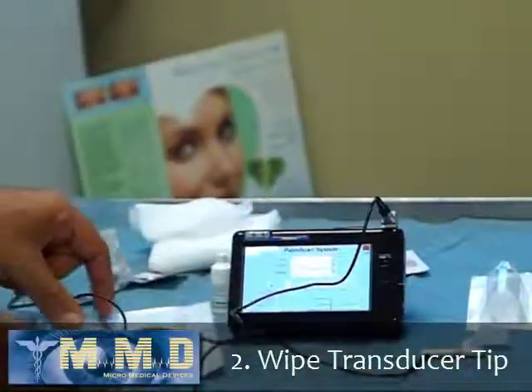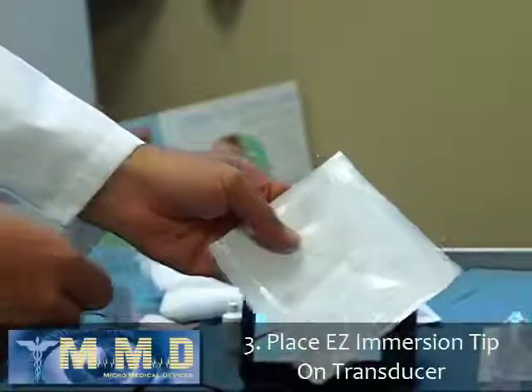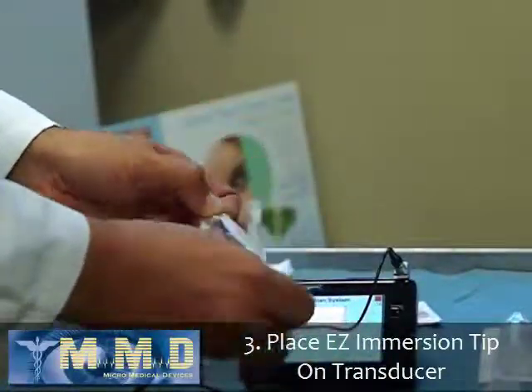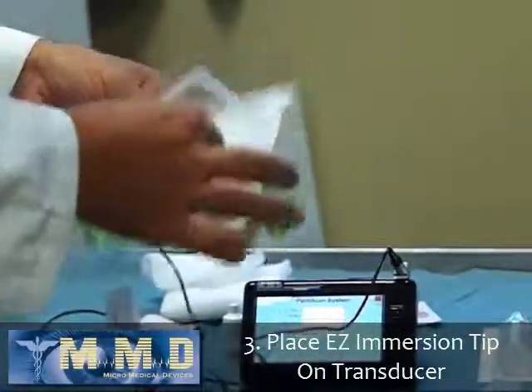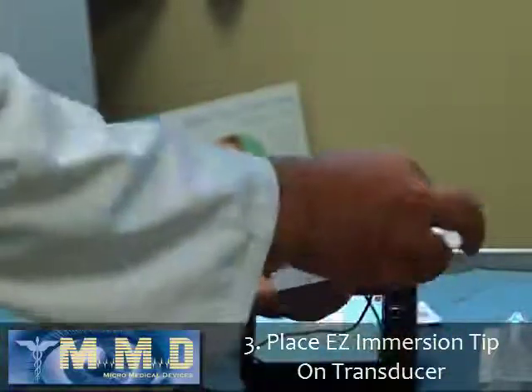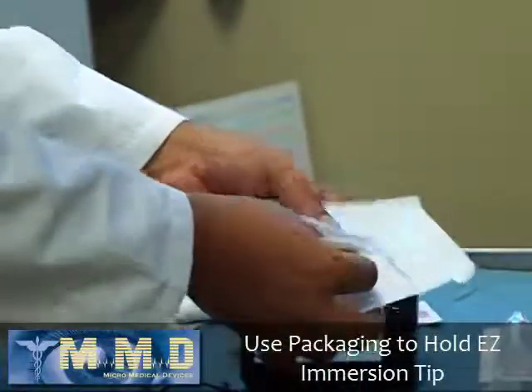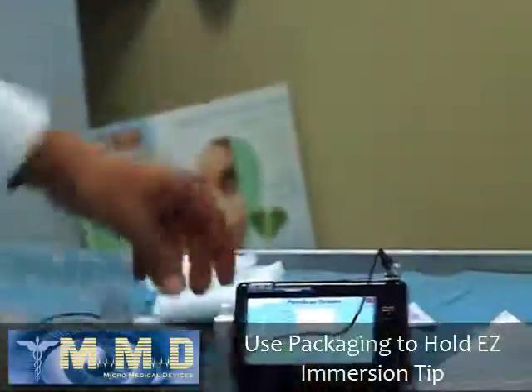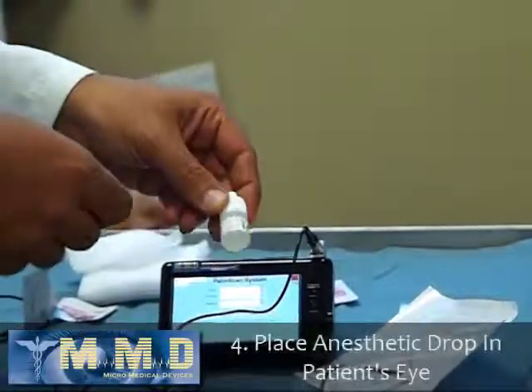And now I'm ready to place the EZ Immersion Tip on the transducer. To do that, I just peel the side of the package and insert my transducer inside the package, being careful not to touch the tip. For now, I just leave the transducer and the tip inside the box, and I instill the tetracaine drop in the patient's eye.